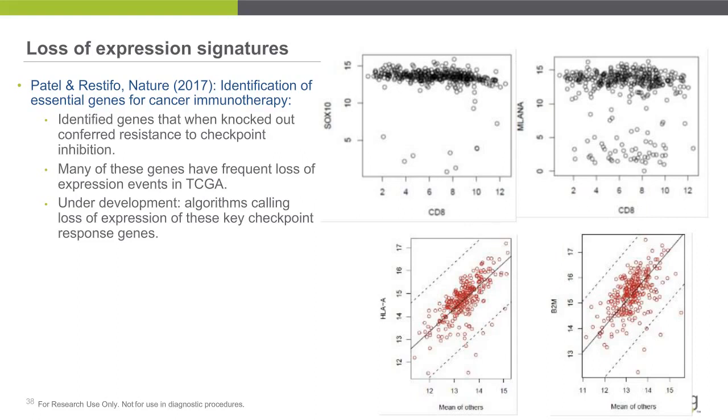And so that can help us to avoid some of the heterogeneity that is introduced into other samples based upon variable expression of a single biomarker readout. And it can also allow us to begin to, for instance, segregate out patients who would respond better to a combination therapy from a monotherapy. And those are two aspects of signature development that other assays currently in development are not able to address today. Thank you.